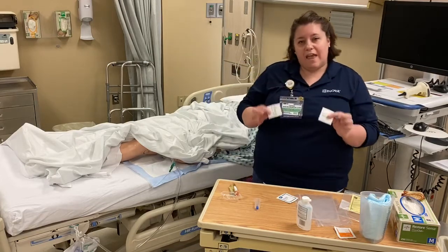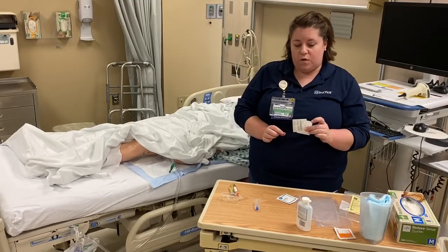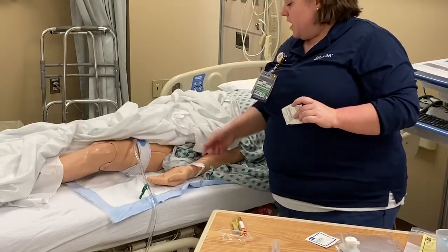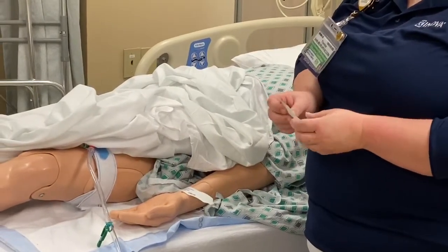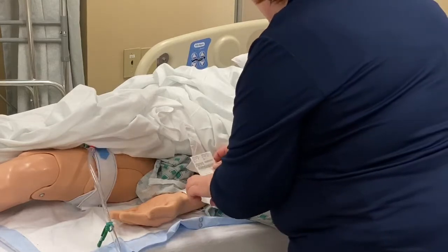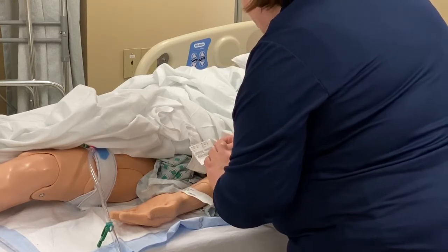Now that I have my labels, I need to verify them for the give me 5, the 5 things that I'm looking for on each label. So I'm coming back over to my patient's bracelet, and I'm going to compare the labels to her bracelet, and I'm going to verify each of the give me 5 things for each label. So I'm looking at the patient's name. So I have Miriam Muhammad, Miriam Muhammad, Miriam Muhammad. I'm looking for the MRN.